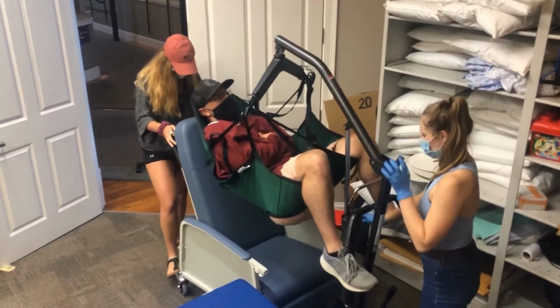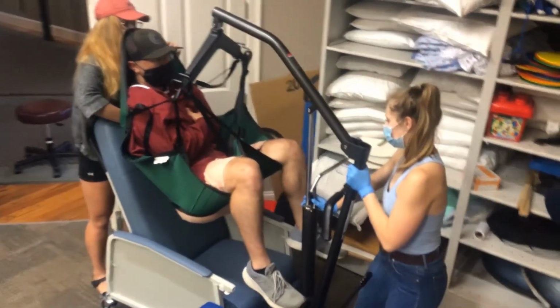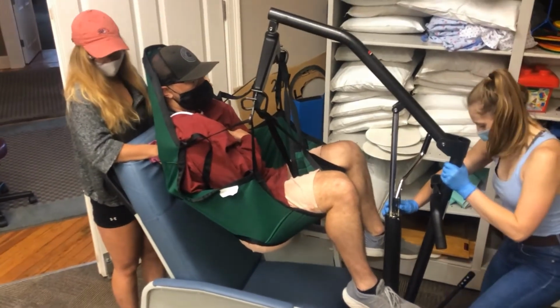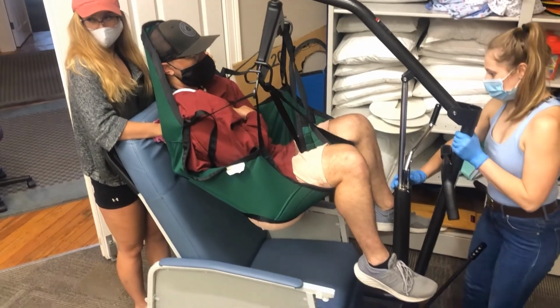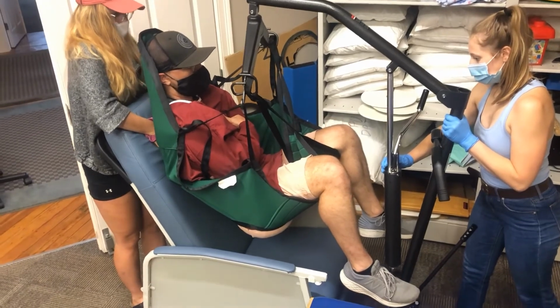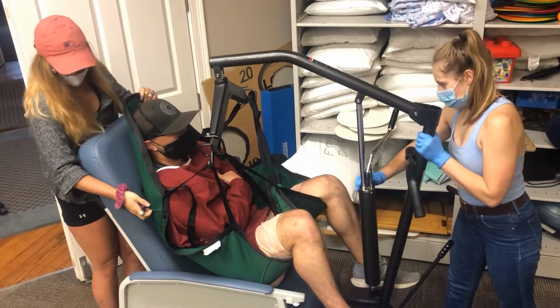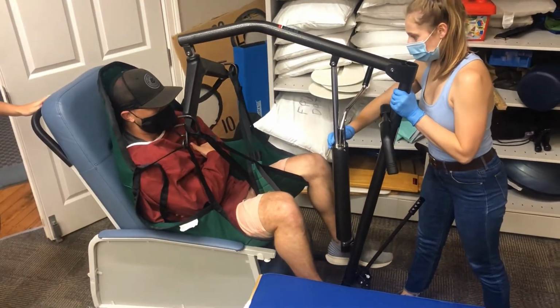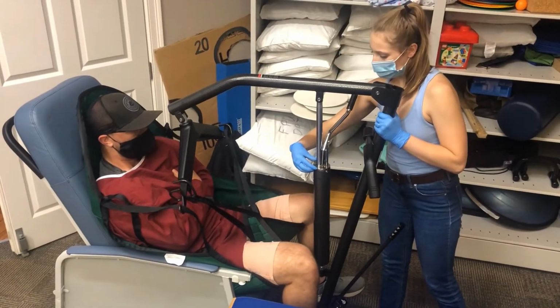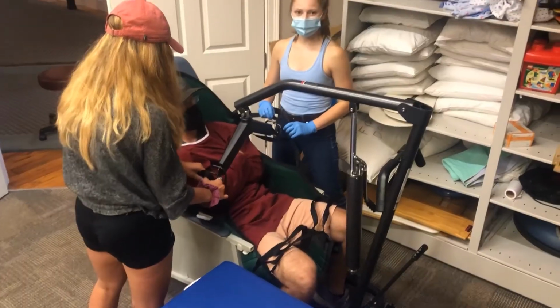Once at your location, relock the Hoyer brakes. If someone else is available, have them hold onto the strap on the back of the sling to further assist your loved one into the chair. To lower them, slowly turn the metal handle located next to the lifting lever. Undo the loops and the transfer is now complete.